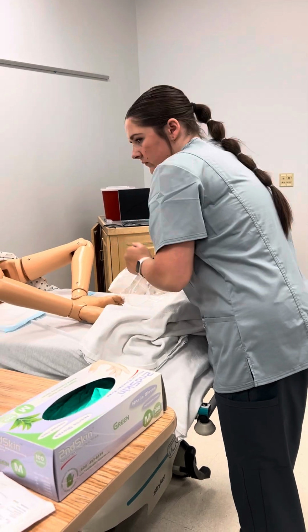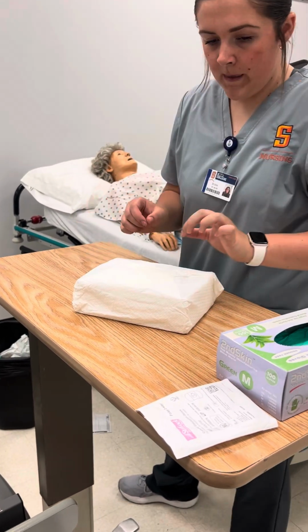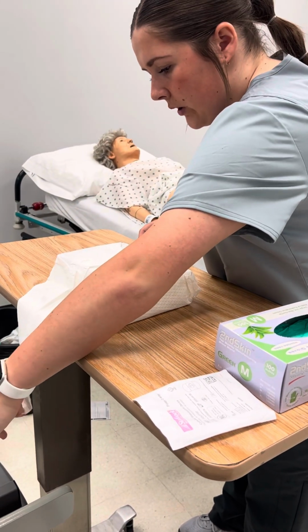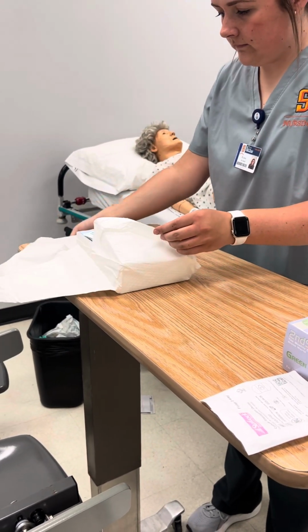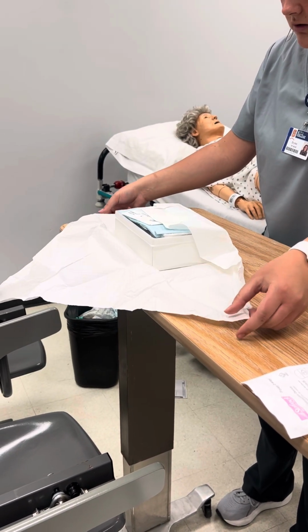We're going to need it. Okay. I'm going to open my catheter kit, pulling away from me. Be careful to only touch the edges. Minding the 1-inch border.